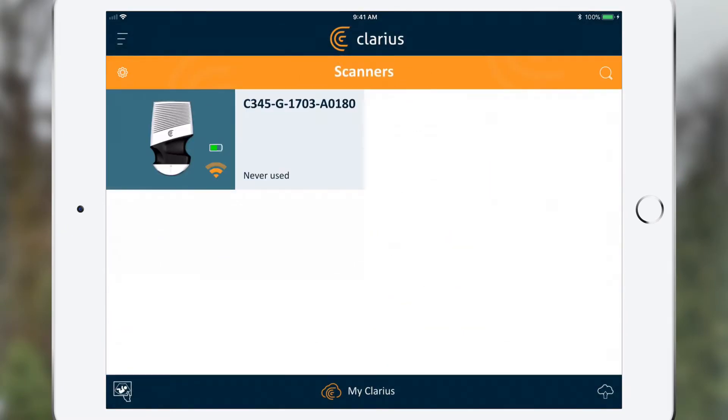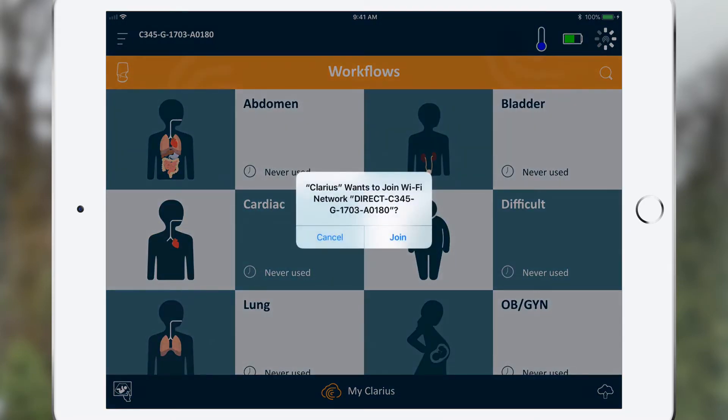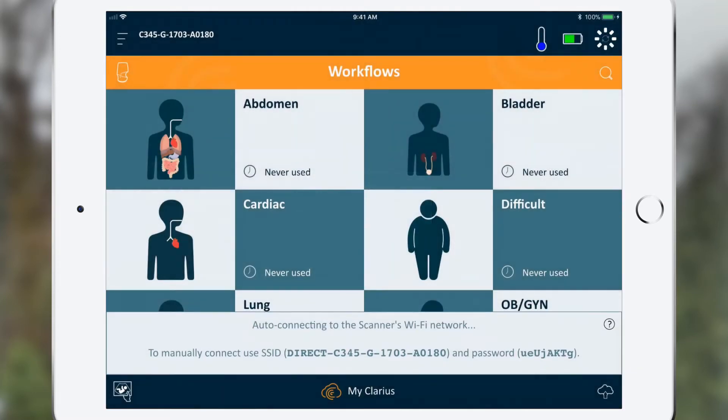The status wheel will spin and a prompt to join the scanner's Wi-Fi direct network will appear. Select Join. This prompt only appears on the latest iOS and Android platforms. Please refer to our FAQs for connectivity with older platforms.